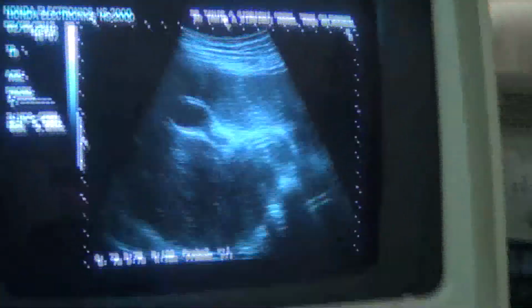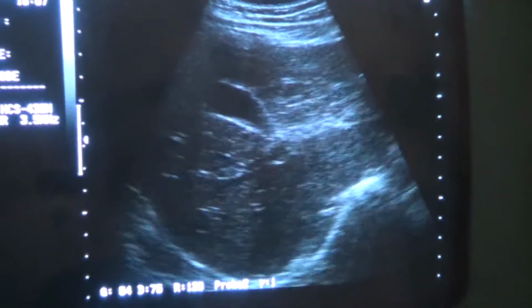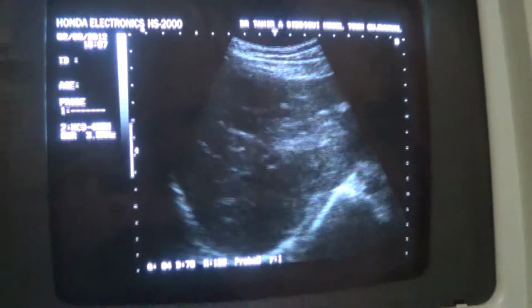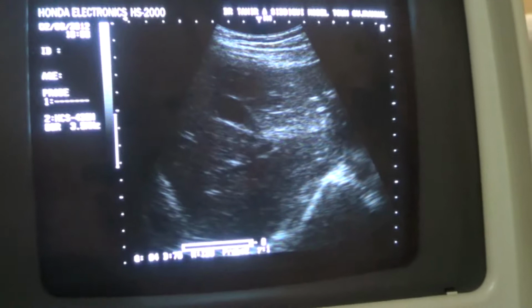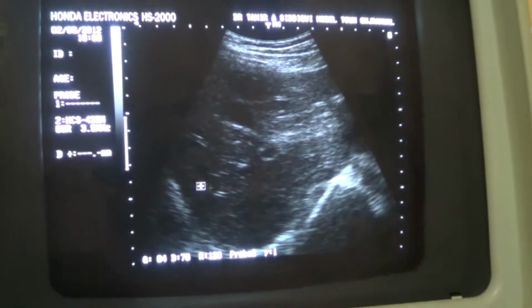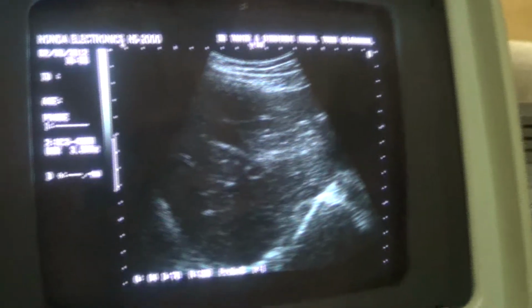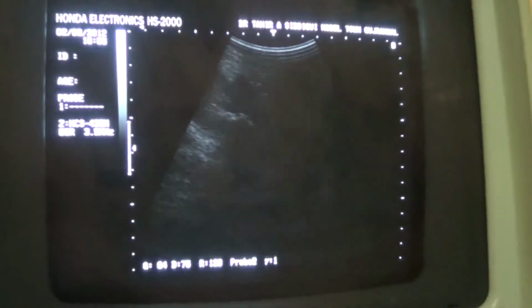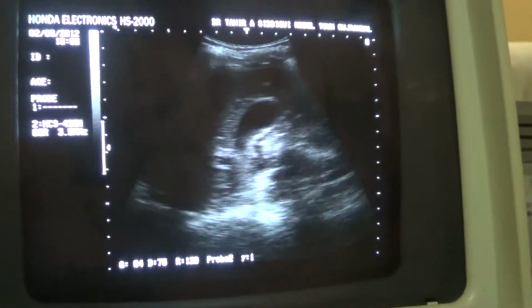Liver. You see that the echogenicity of the liver has gone down much. That's the reason why you are able to see the multiple tiny, 1, 2, 3, 4, 5, 6, 7, 8, 9, 10, minor portal vein radicals. These are seen in diffuse decreased parenchymal echogenicity when the echogenicity of the liver has gone down.